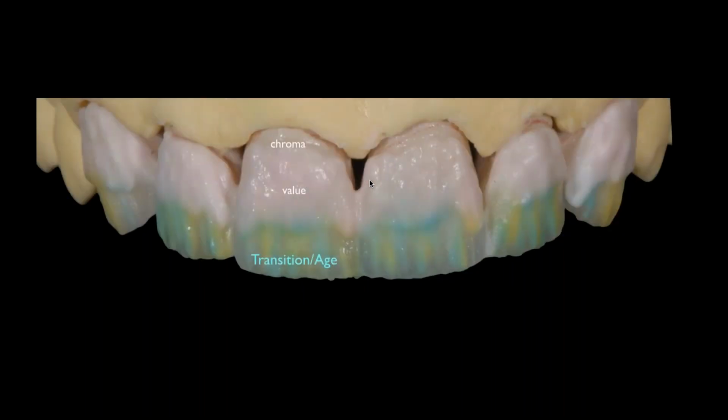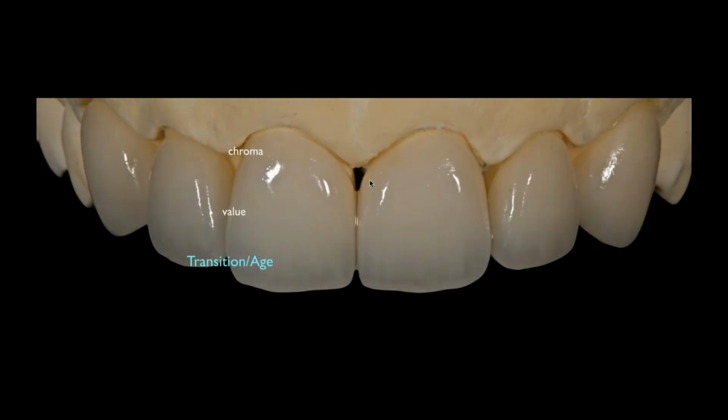But in the end, the concept is the same. Chroma, value, age, transition, always the same. That doesn't change for me. All that changes is how bright or how warm I want the case to be. So if I'm looking for a 1M1 case, I want to make sure that I'm using maybe 1M2s or 2M2s or even 3M2s in the cervical, and then jumping to the white or brighter in that mid-third, and then the age and translucent.